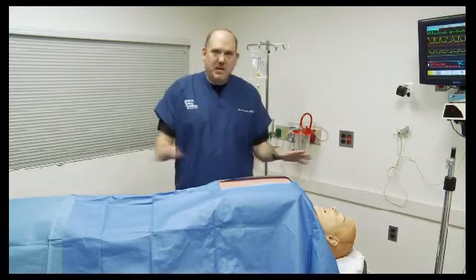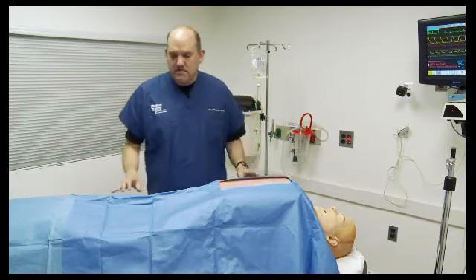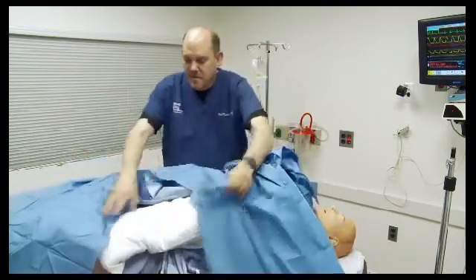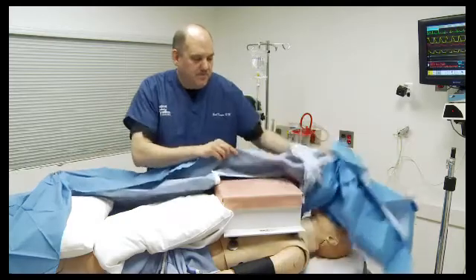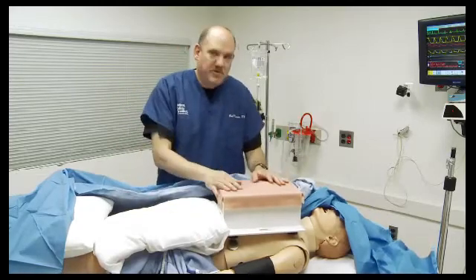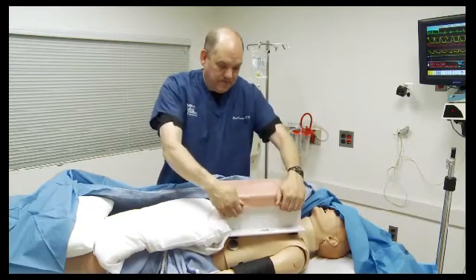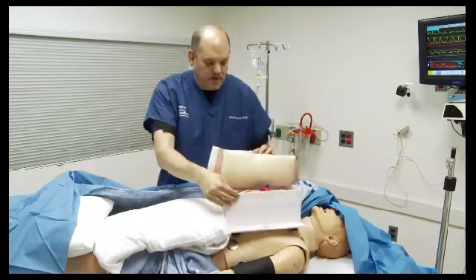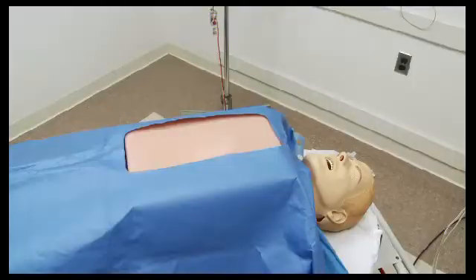So what we've done here is we have SimMan. He's laid out, connected to all of his pneumatics and electronics. Underneath him, underneath his surgical drape, we have basically padded up the under part of the drape to make the size of the body look consistent. Up top here, we have a commercially available project box — this particular one is from Simulab in California. It has very realistic skin which peels off with Velcro, and underneath the skin you can see there's a very realistic fat layer.